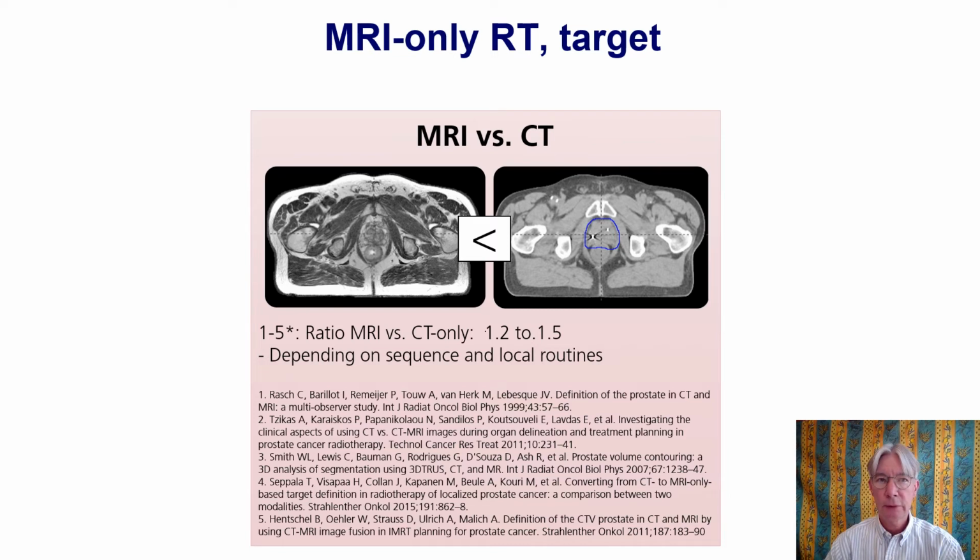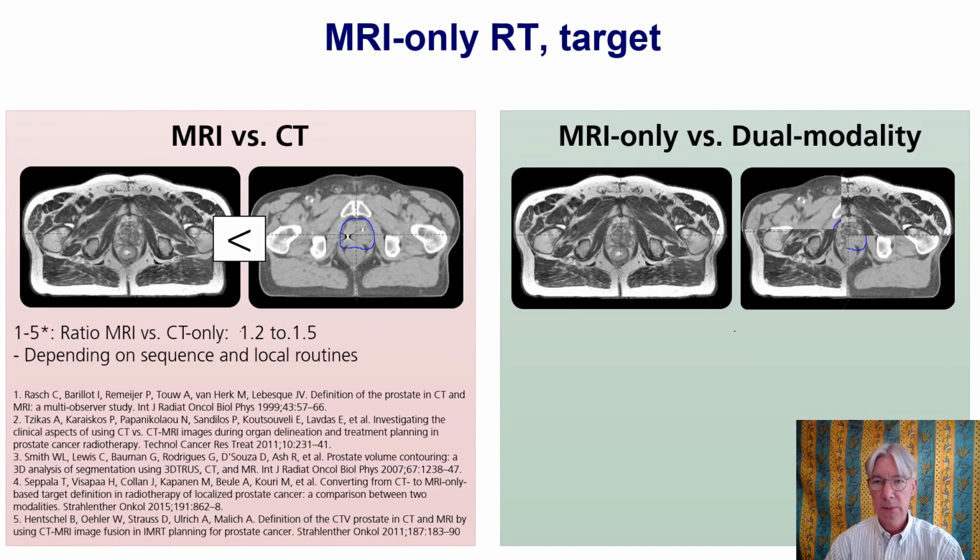However, this is not a fair comparison to the case going from multimodality to MR only, because in the studies to the left they only used MRI or only used CT, but in a dual modality workflow you actually use MRI but register the information to the CT.